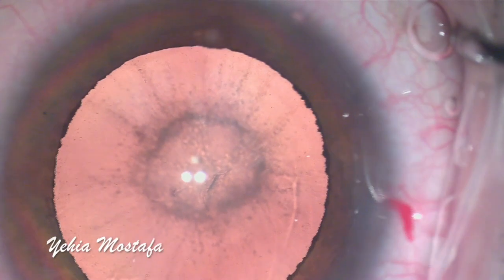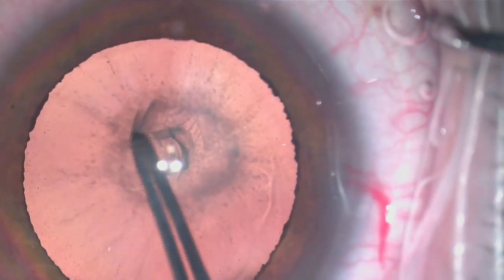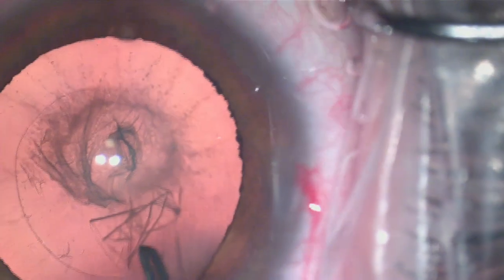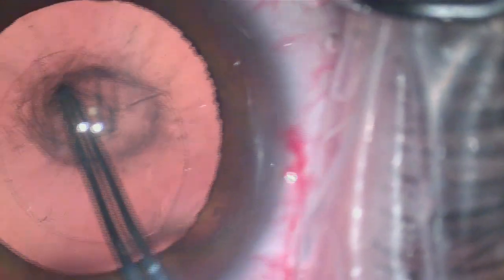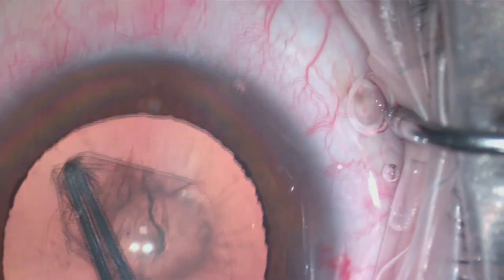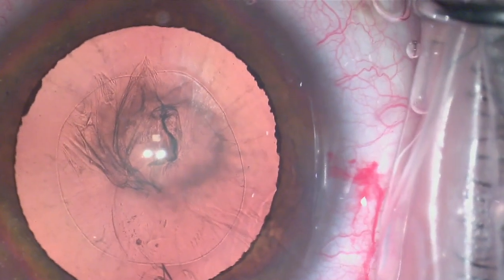The following rules include holding near the tearing edge, not at the tearing edge, and then moving every two o'clock hours in a systematic way, and bringing the flap to the center. Using proper magnification makes it a completely reproducible step to achieve a continuous circular capsulorrhexis.